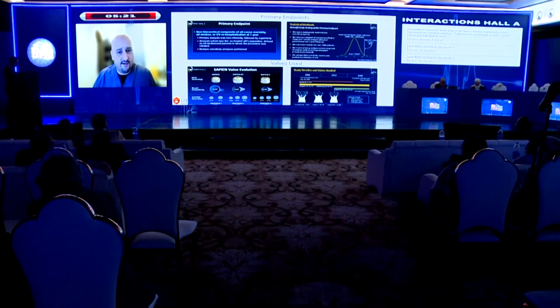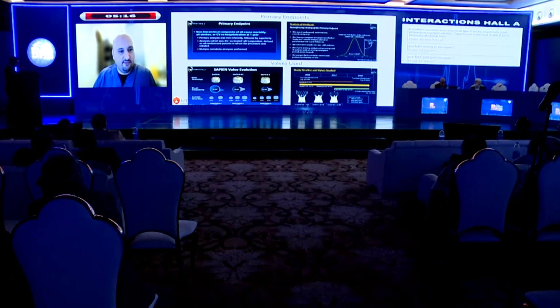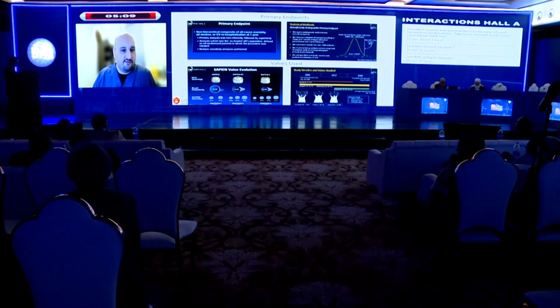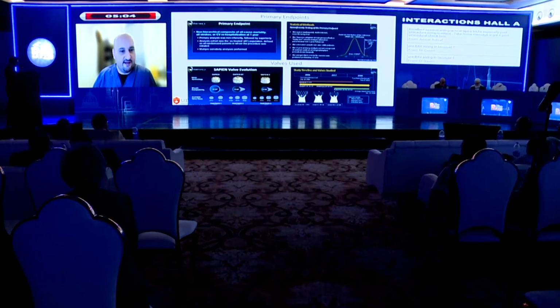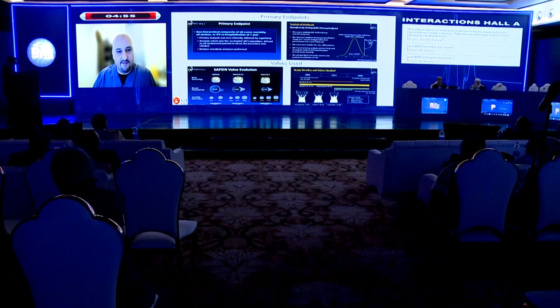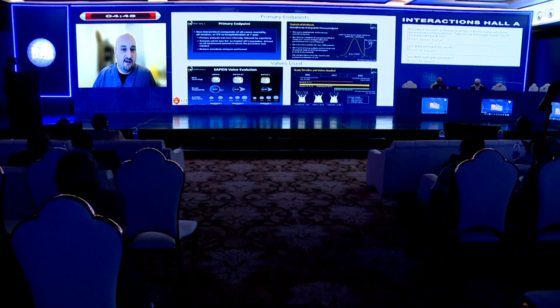Some secondary endpoints. Now here, this slide shows that by the time we get to the low risk trial, we moved at least two generations on the Edwards SAPIEN valve to their S3 valve, which is an improved design, has a skirt to prevent leak, and has smaller sheath sizes. Similar improvement was seen where a lot of patients got the Evolut R and Evolut Pro in these trials, which are the improved second and third generation self-expanding valves.